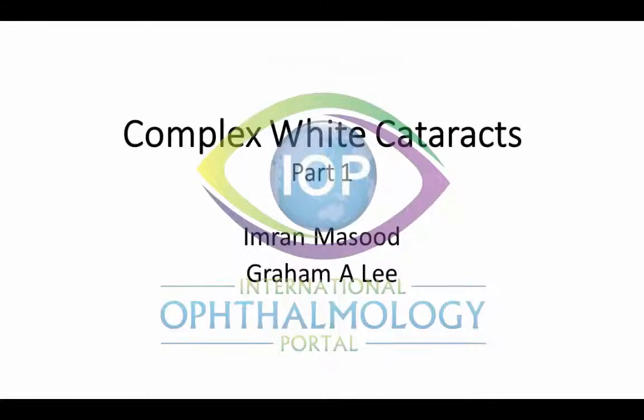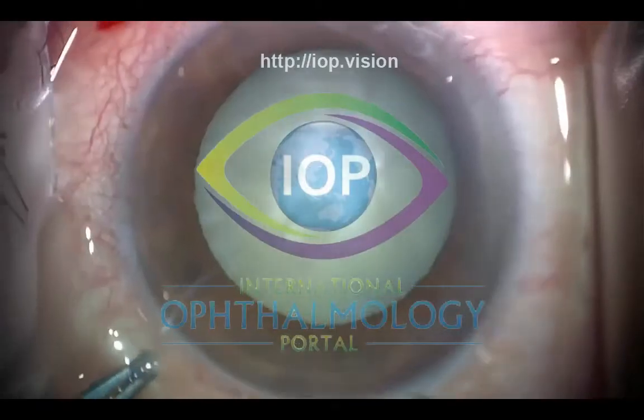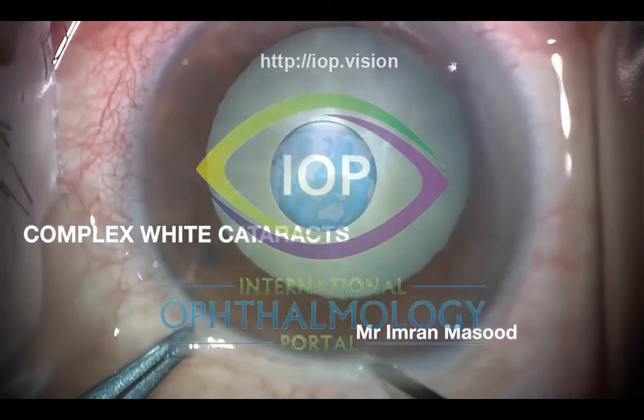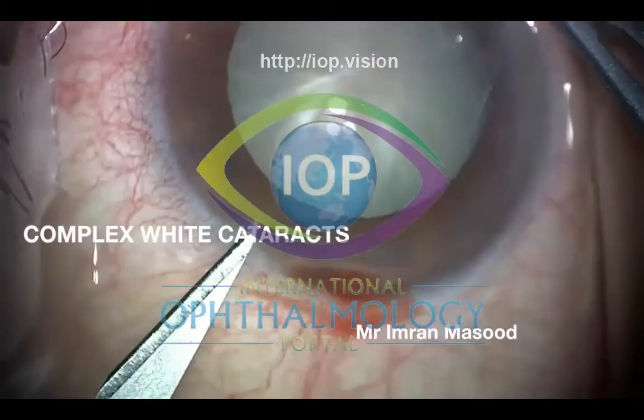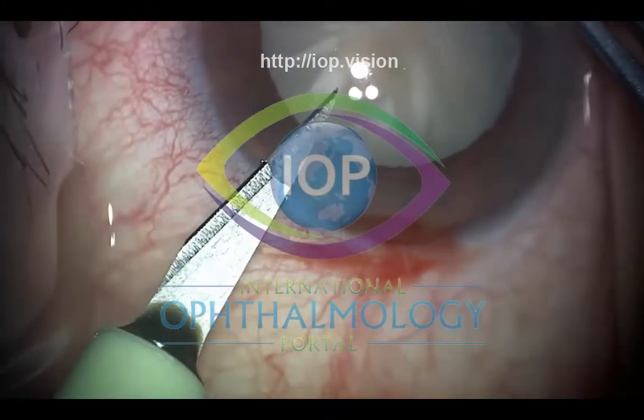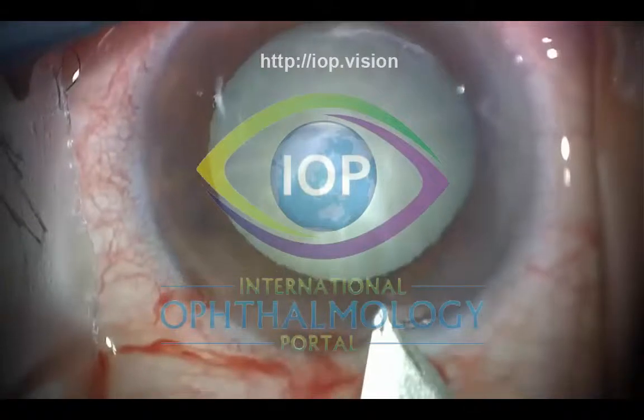What I've done with this compilation is go through a series of cases of white cataract where it may not be as straightforward. We know that white cataracts are difficult in themselves, but here I'm showing three videos where there is an added layer of complexity. The first case is a patient who presented with angle closure glaucoma, short axial length, and a white cataract.